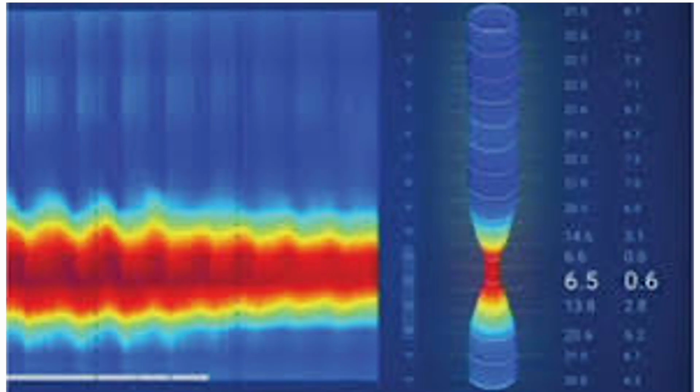The interpretation of this: normal EGJ distensibility should be more than 2.8 millimeter square per millimeter mercury. But here you have only 0.6, which shows it's not opening. This strongly suggests either EGJ outflow obstruction or achalasia.